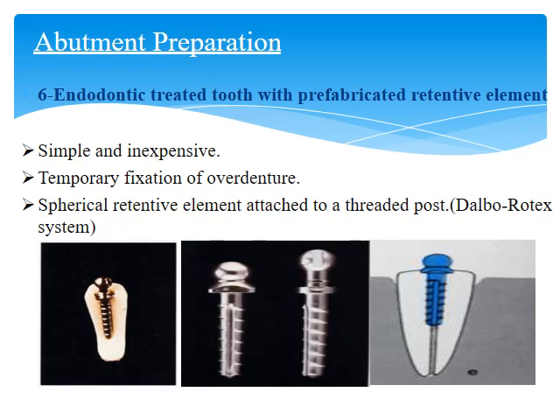Endodontic treated tooth with prefabricated retentive element. Simple and inexpensive way. Temporary fixation of overdenture. Spherical retentive element attached to a threaded post like Dalbo-Rotex system.